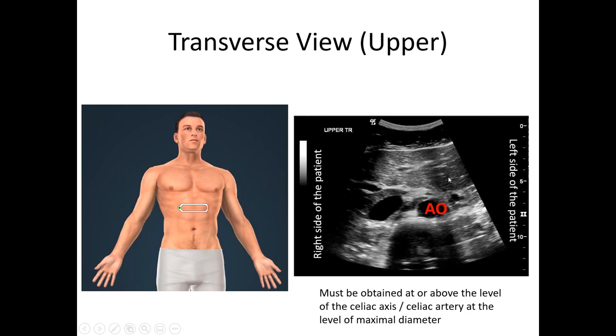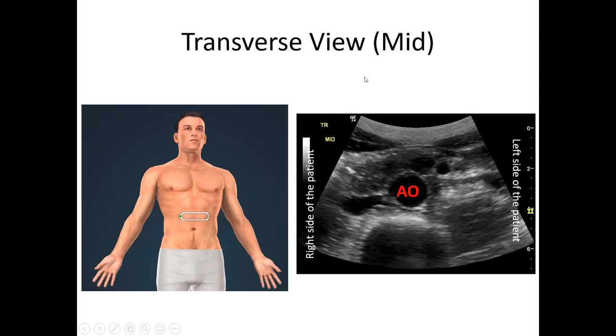And so anteriorly, you should see the liver. Also make sure your depth is adjusted well, so you're able to see the structures without cutting it. This is the view to the mid-abdominal aorta, and in this level, you will definitely see aorta in the spine, and just measure outer wall to outer wall. If you do see an aneurysm or dilatation, you want to also measure side to side, because sometimes the diameter could be much more on the lateral aspect as compared to anterior posterior. And the management is based upon the maximum diameter that we get.